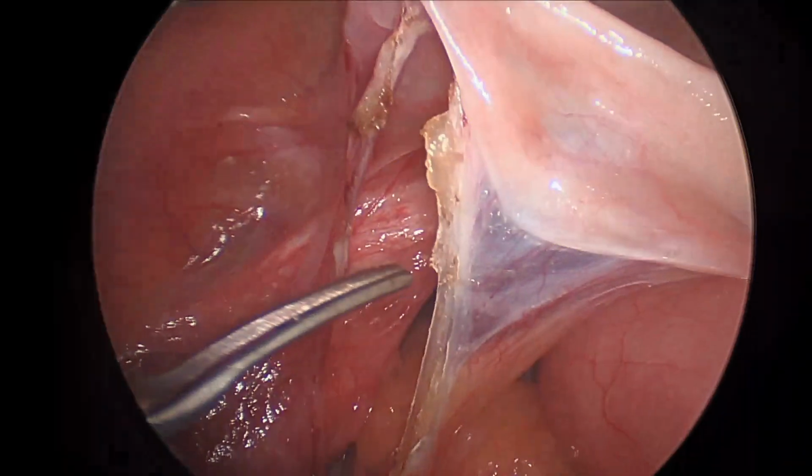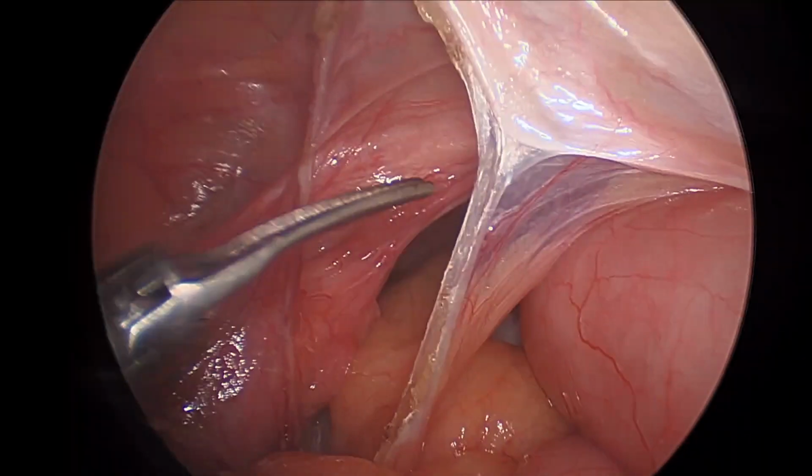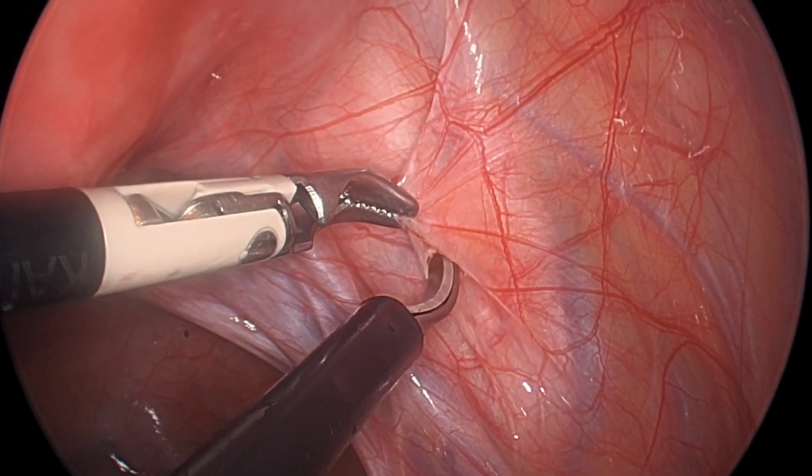Here you can see the Metzenbaum scissors hovering just above the tissue and being activated with a cutting current. This method of vaporization allows for a scalpel-like effect. Vaporization can be effectively applied in the setting of excision of endometriosis.